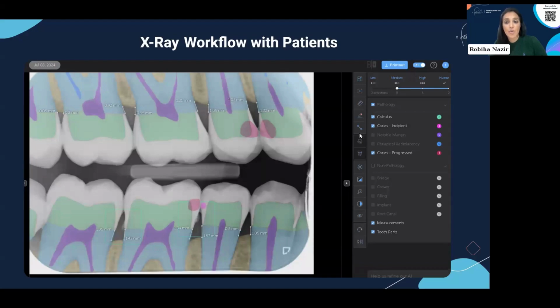The fifth one is your edit measurements. So this one will allow those white lines. They are usually white up until 2.5, yellow from 2.5 to 4 millimeters, and then orange from 4 millimeters and above. You can change this in your settings in increments of 1 millimeter. We then have measurements, which I was just talking about, that you can switch on and off.